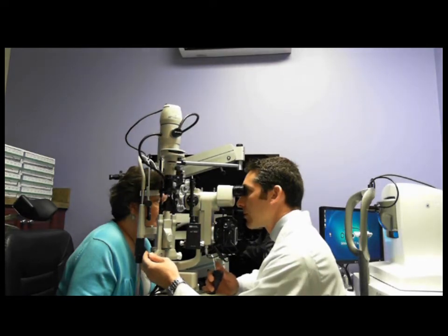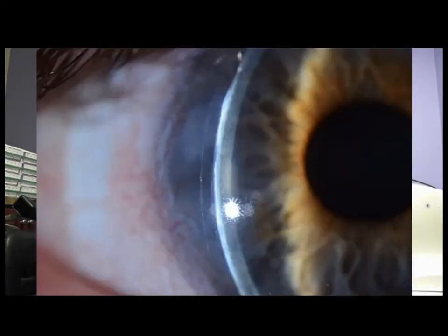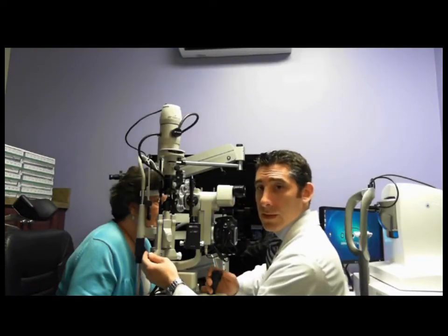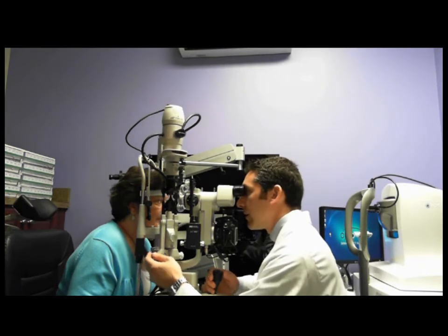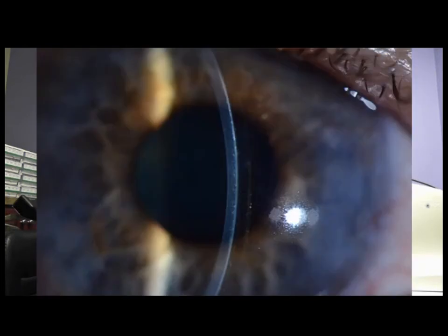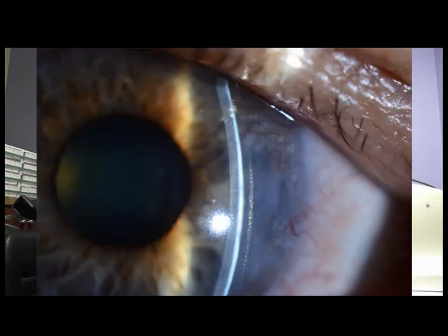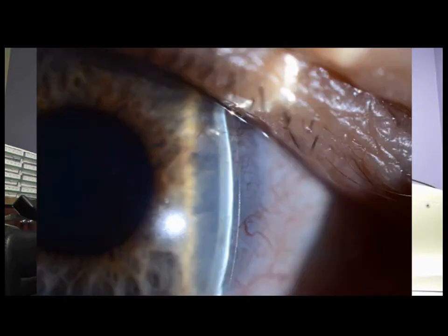And as we move towards the periphery, the temporal periphery of this lens, we still have good vault. I think that comes out in the images. All right, let's move over nasally, and I'm going to take images that are moving progressively more nasally. And it is the case that we're bearing on the nasal cornea. Let's take a look at the haptic.